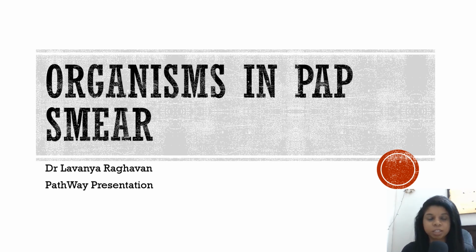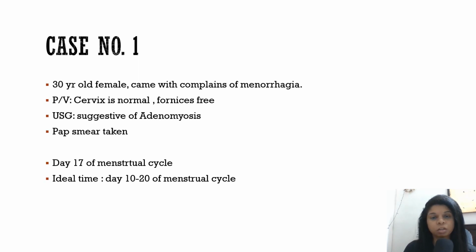Today I will be taking the second part of pap smear reporting, and that is about the organisms that you can find in the pap smear. So I will be discussing it as case scenarios because I think it should be a little bit more practical in approach, like as we get in OPDs, site OPDs about the pap smear.